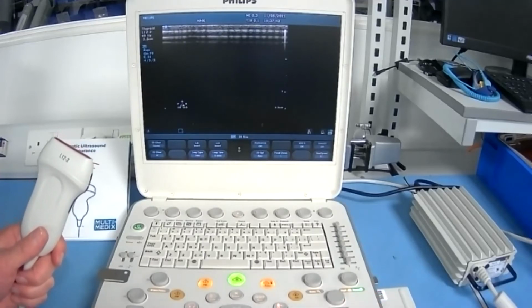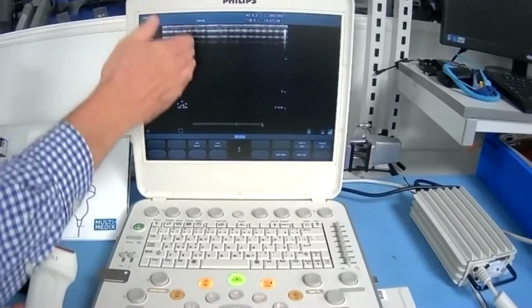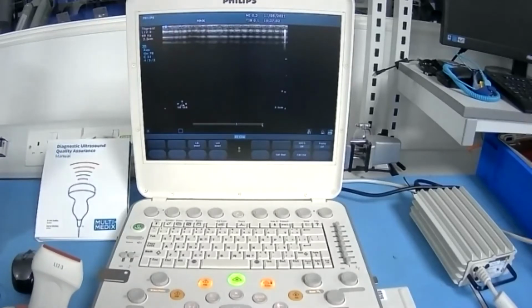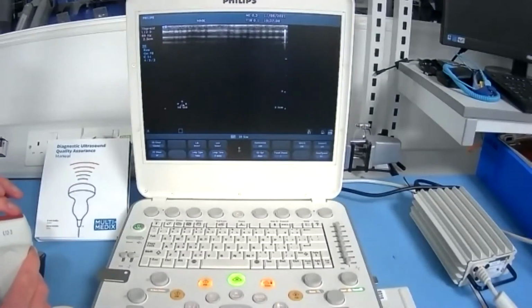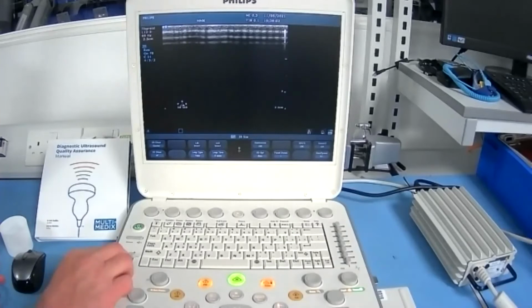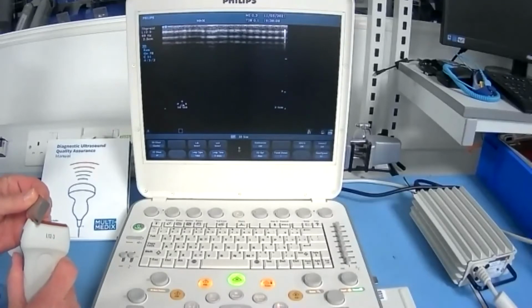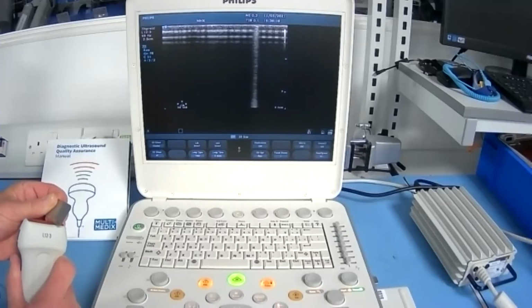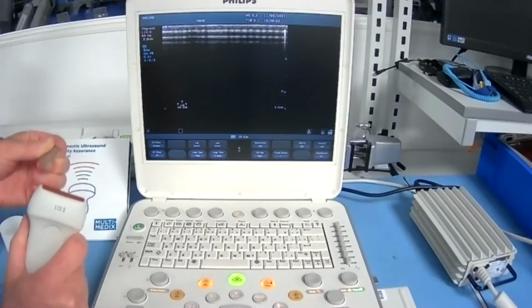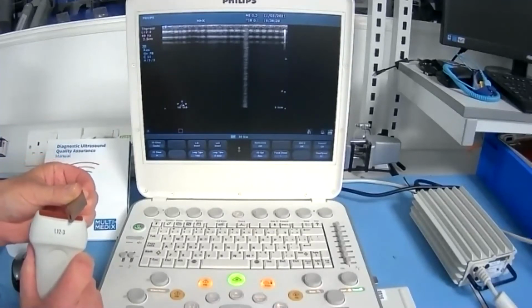And I think if we just freeze that a moment, we can see that that's changed dramatically to our eyes. So we can see a lot of the dark bands that Nick was talking about. When it's in this mode, we can apply the dropout test. Typically apply a small film of water to lubricate the lens, and either a paperclip or a test tool that Multi-Medix has available. We use that just to sweep across, as Nick's described, and we will see flashes of it going on and off as I move across the dark axial bands. And that's an example of just how easy it is to very quickly identify non-functioning elements or cable breaks.